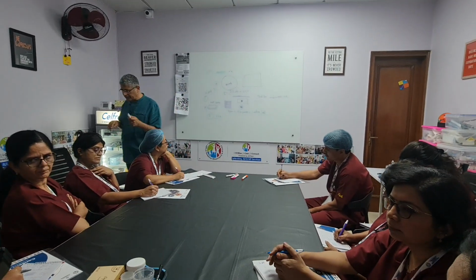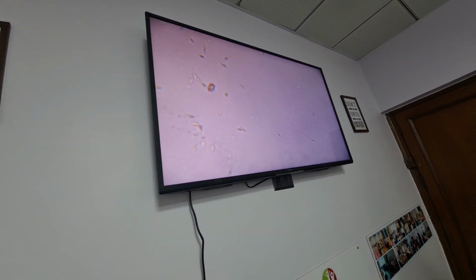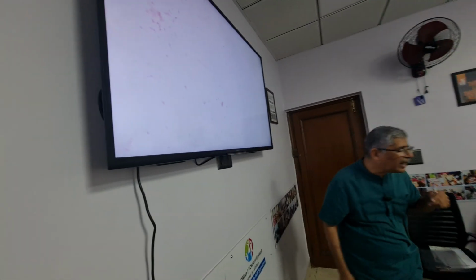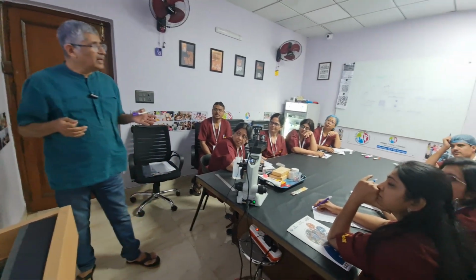Because of the length. In case you look here, I want to show you: this is 40x. Are you with me or not? Yes, sir. At 40x, we are able to see this image. In case I want to go to 20x, I get this image. Where will my focus go now? Towards me or away? It's worthwhile understanding. Whenever you want to go to a higher magnification, the objective comes towards us, and when we go to a lower magnification, it is away from us. So I am coming from higher to lower.